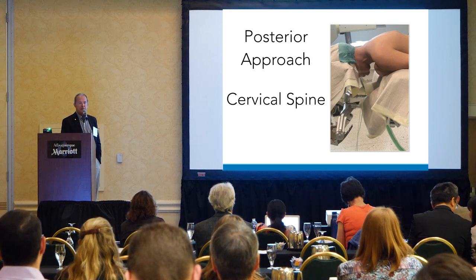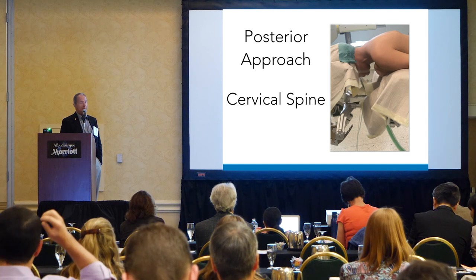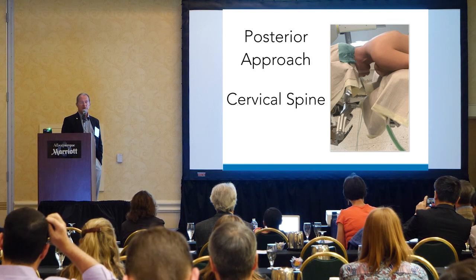Dr. Rutten uses tongs to position the patient. The biggest problem is getting the shoulders out of the way, particularly with men, particularly with big, thick necks. It's tough to do. I don't use tongs, but if the table is tilted, there are wrist wraps around this fella, and it pulls down with maybe 10 to 15 pound weights on each arm.